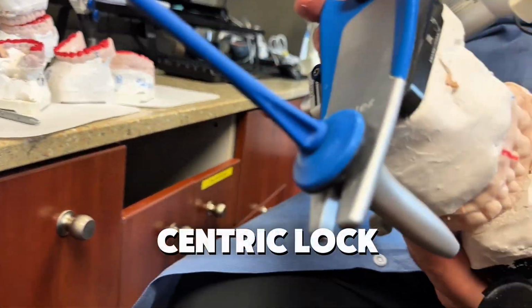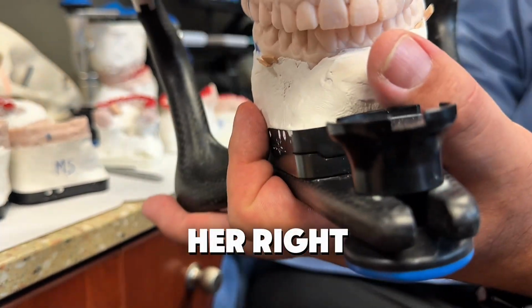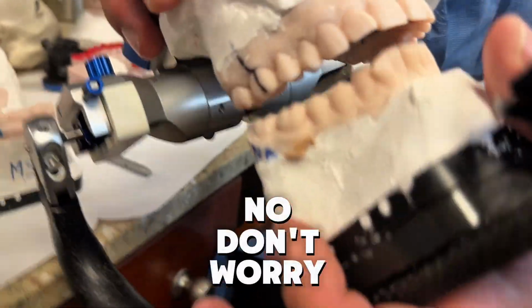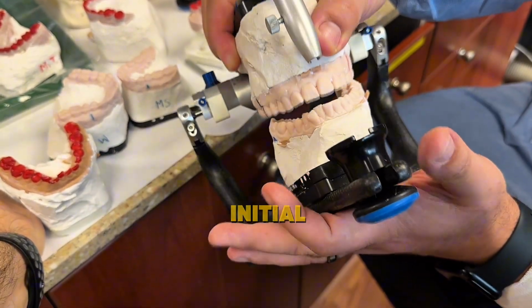Now, on the other patient, she said when she bit down, she went to the left side. I'm going to lock the centric lock. What do you think of her bite? It's open on the right. Left. All right, that's what she said. I only hit these teeth when I close. Now, when I unlock it, don't worry about that degree. This is just her centric bite. Now, if I squeeze the teeth together, they fit together. But her initial bite is here.